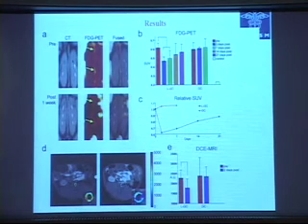What's really exciting about this is that with a single injection of these liposomal glucocorticoids, Willem has shown that only 2 days after, we have an incredible reduction of inflammation, as shown by FDG. This shows one injection, you wait 1 week only, and there is total suppression of the FDG signal, and a very nice change in the angiogenesis after the delivery. This is very exciting because now we have to understand how long we need to do this, the frequency, but it really shows a rapid response from the drug, and we can measure that by the imaging.